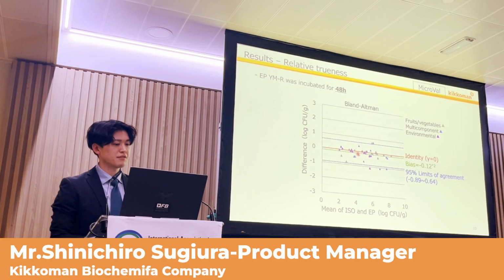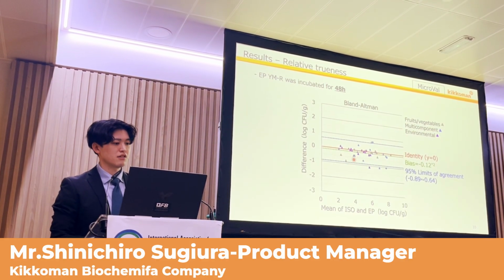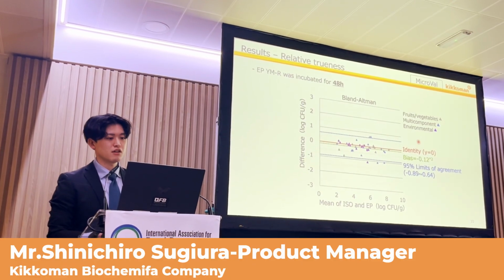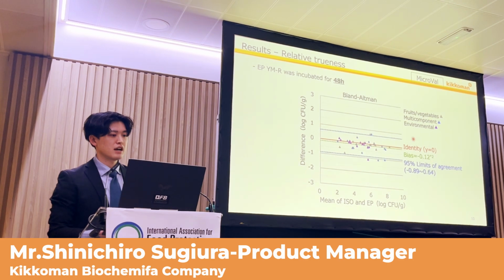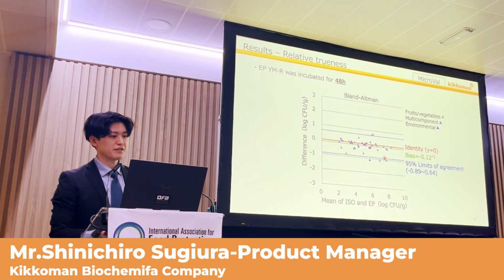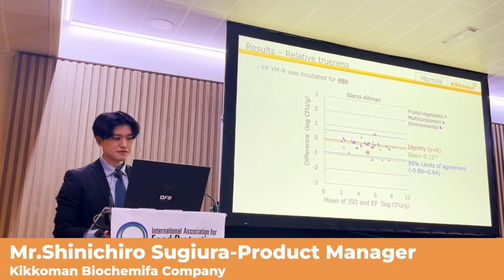And that was the results of 72 hours. And for categories of fruits and vegetables, multi-components, and environmental samples, a good agreement was also observed at 48 hours.